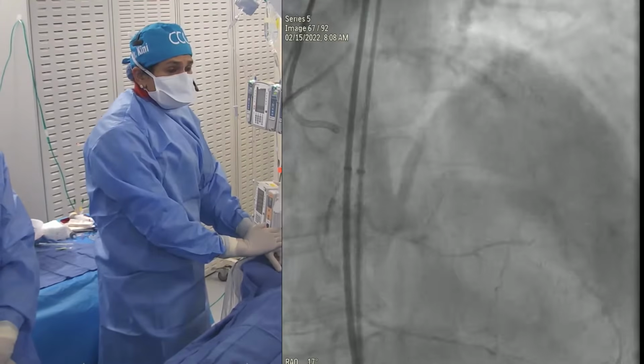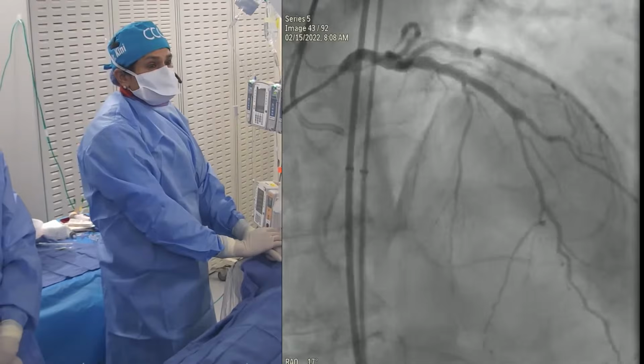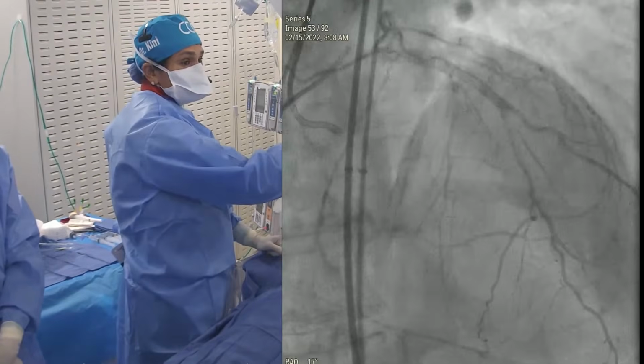And I think if you think about retrograde, look at the septal. We are talking about probably the fourth septal, way further down in the distal right. LAD, yeah, that's what I meant. It's too distal.